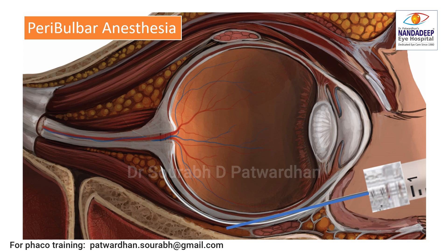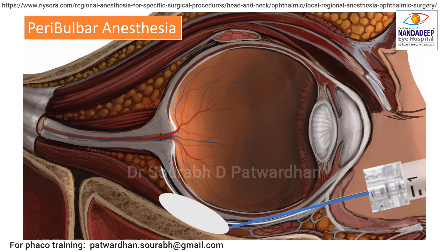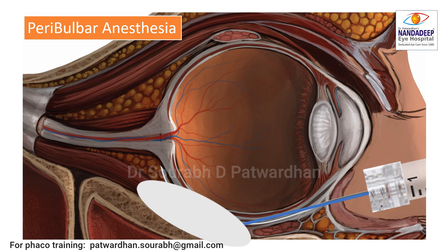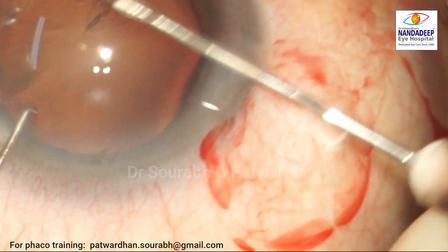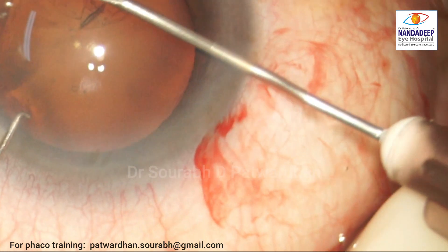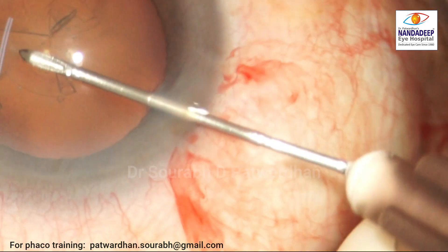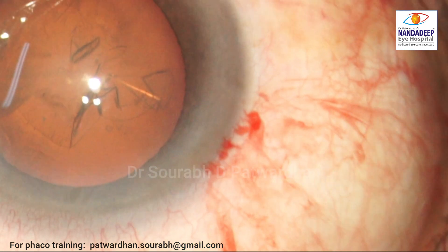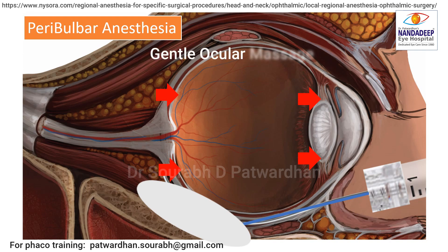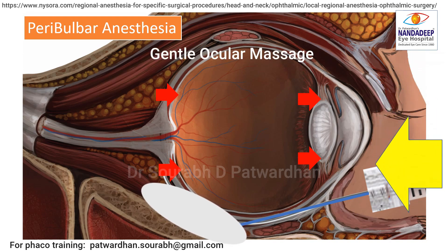Remember, I am doing this case under peribulbar anesthesia. When we give peribulbar anesthesia, there is increased intraorbital pressure, and this further leads to pushing of the globe anteriorly. And when you incise the cornea, this pressure is going to push everything out. So I gave peribulbar injection here because I was doing a combined phaco-vitrectomy, and the intraorbital pressure remained high. That was the reason.